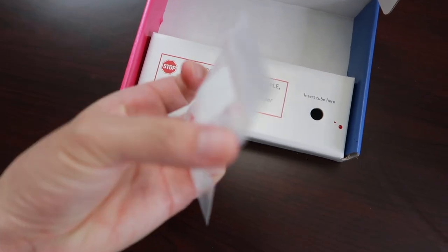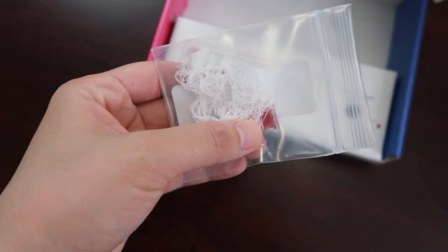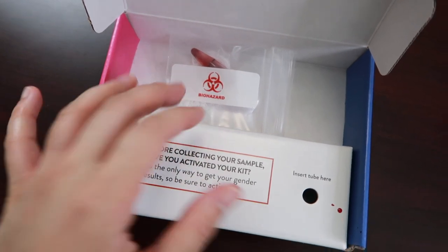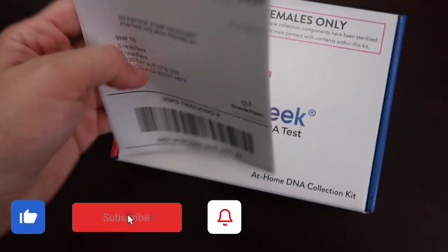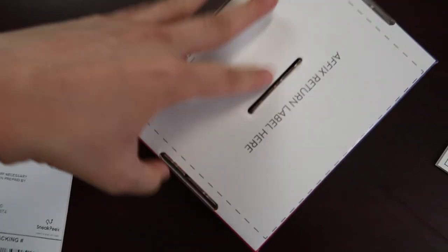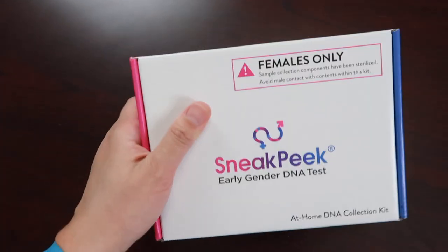We're done collecting the sample. I already put it in a resealable bag with the gauze inside, and the collection tube is right there. The instructions say to put it back in the test kit and close it using the adhesive strip — there it is. Now it's closed. I need to stick the return label that was included in the box right here on the back, and it's ready to be sent back to the lab.